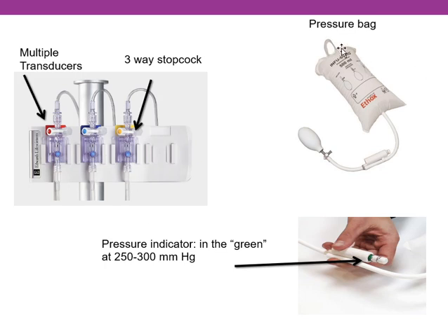Here's your pressure bag. I will put the saline in here, or the heparinized saline, and here's the indicator light that says we're at 250 to 300. There's actually a little mark that says 250. If you get beyond 300, it turns red and says you don't need it that high. The reason we put it under pressure is if I take this non-compliant tubing, which means it's very, very hard, it's not soft like pump tubing, and hook it into your artery, which is under pressure, blood's going to come out through the tubing. So we put the system under pressure so that blood does not come out.